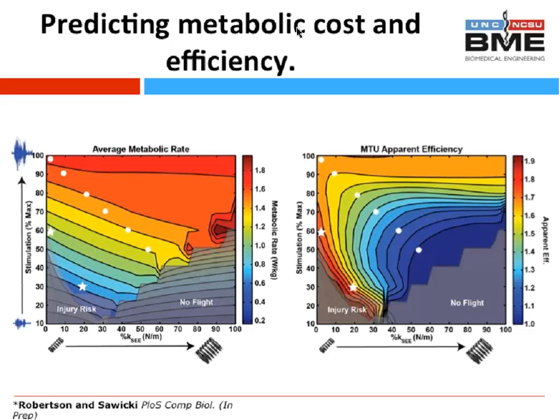Major motivation for looking at soleus was actually that it is the largest by far in terms of physiological cross-sectional area of those 3 muscles. So in terms of trying to link what's happening at muscle tendon level to the joint level, and then potentially even, although you're getting into slightly shaky territory here, to the whole body net metabolic level, we felt it was best to choose the largest muscle, which represented the muscle that was producing the majority of ankle torque, doing the most work at the ankle joint.